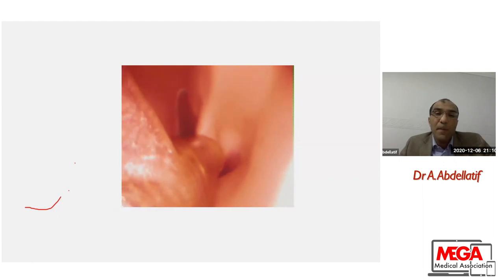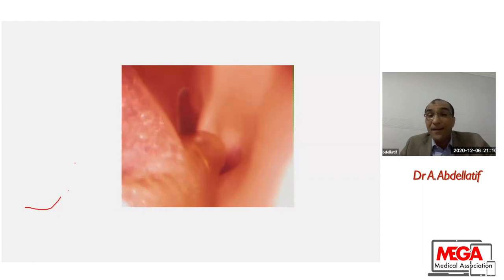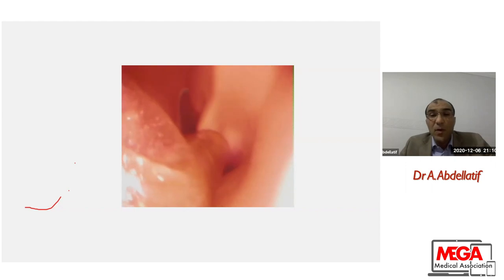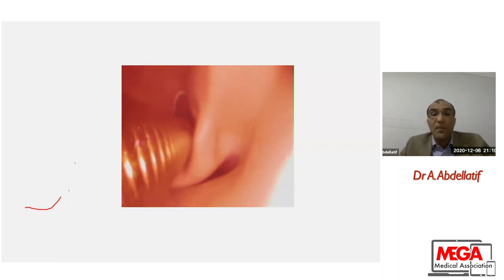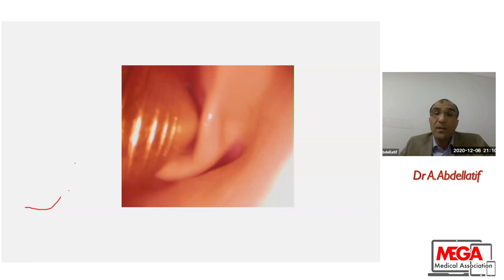Now I put the scope in the trachea and am waiting for the tube to come for intubation. Here the tube comes and is impinged with the right arytenoid cartilage. And we are trying to push, to push, to push. No, this is not good. So I have to remember that I have to withdraw the tube 0.5 to 1 centimeter, then rotate before pushing the tube, and then the tube passed inside again. So when you face a difficulty in advancing the tube over the fiber optic, just remember this video.